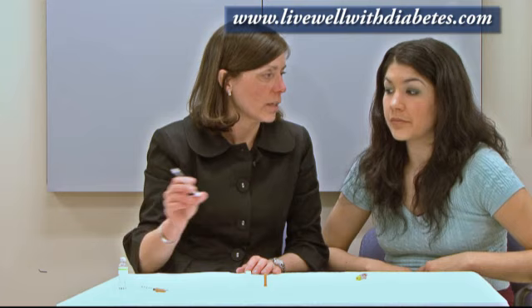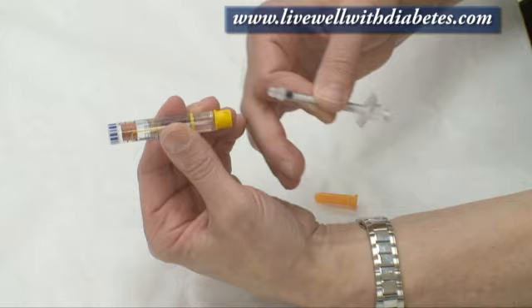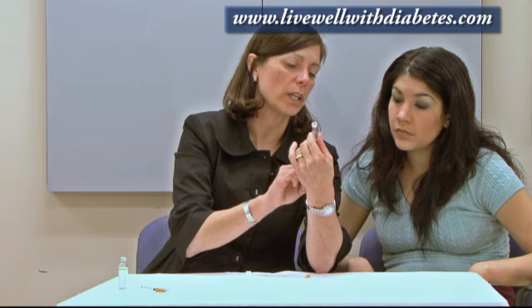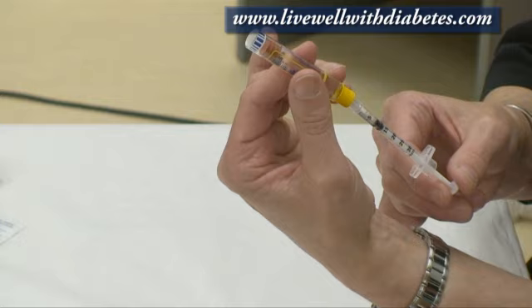Let's go over the key points again. When you're ready to put the needle in, insert it into the yellow tip or the colored end of the cartridge — not the orange plug. Pull down once; the first time there's usually air, so push it all the way back up. The second time, go past the dose you want so you can clearly see the exact number, then adjust to match it. When pulling the needle out of the cartridge, always hold it from the barrel — not from the end — so you don't change the dose.